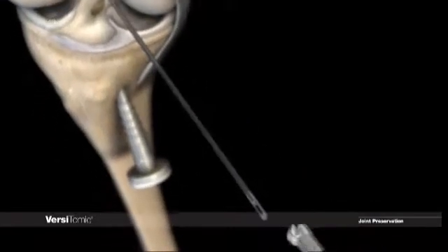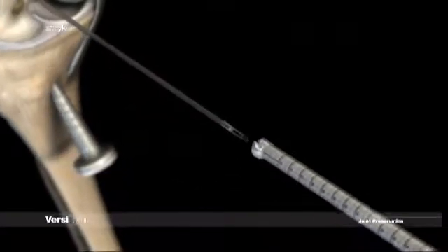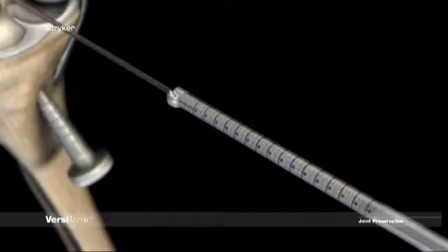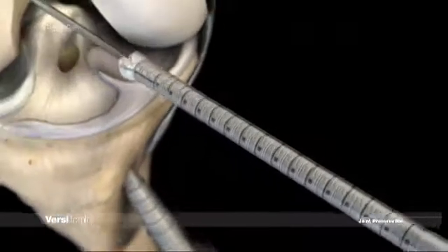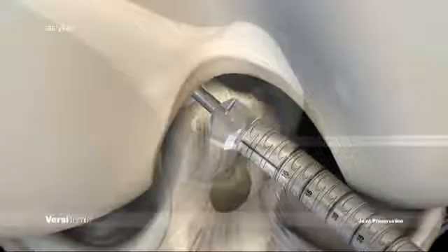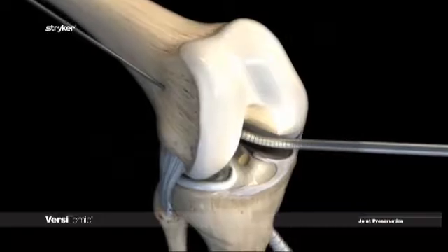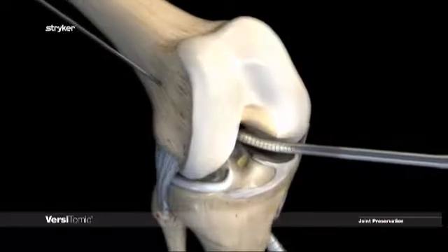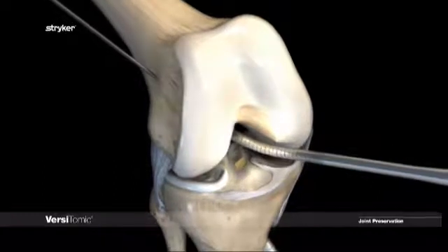To ream the femoral tunnel through the anteromedial portal, reference the markings of the eccentric head. Insert the Versatomic reamer over the guide pin with the single cutting flute away from the medial femoral condyle and PCL. Drill the femoral socket to the desired depth based on depth gauge measurement. After the desired tunnel length is reached, run at full speed up and down the pin for debris removal.